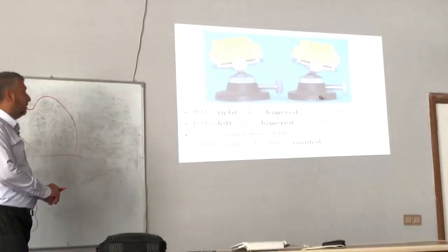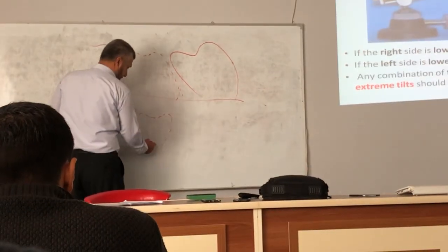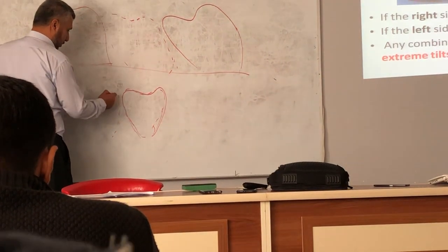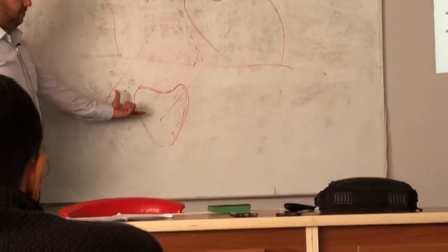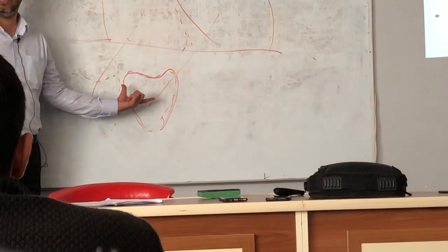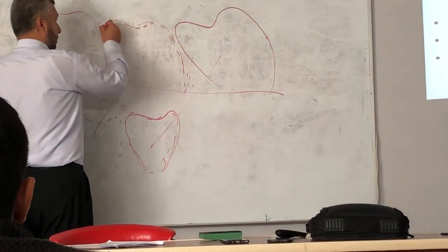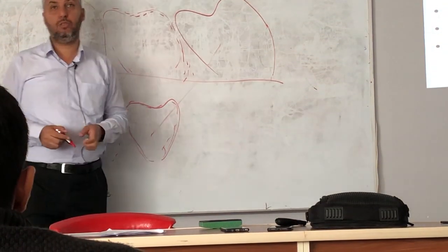Once you tilt the cast, during tilting, this tooth will be vertical. And I will arrange my tooth. This one, and it's vertical. It's easy for arrangement. But once the patient wears the denture, it will be like this. It follows the same curvature of the adjacent tooth.